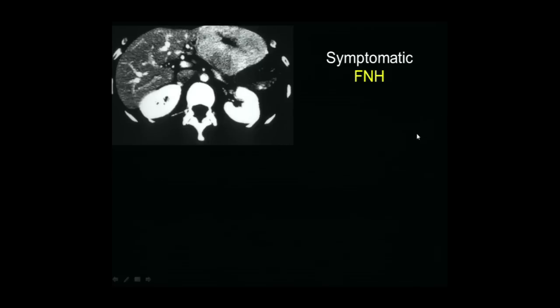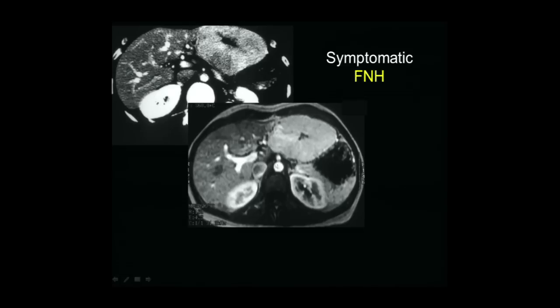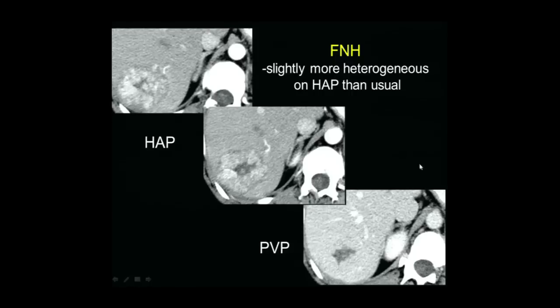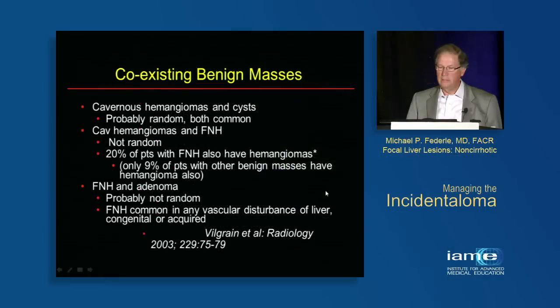Here's a young man with a symptomatic FNH — in my experience these are often symptomatic when hanging off the left lobe, in the epigastric region, where it gets compressed by seat belts and steering wheels. On MR, arterial phase enhances homogeneously; the central scar is bright on T2-weighted images — unlike fibrolamellar carcinoma, which we'll discuss shortly. Here's a slightly more heterogeneous lesion than usual but with the other criteria: hypervascular on arterial phase, central scar, mostly isodense to liver on portal venous phase, and a basket of draining veins into the hepatic veins.